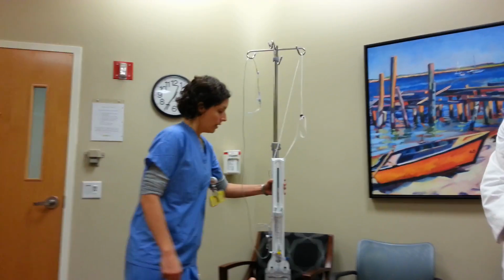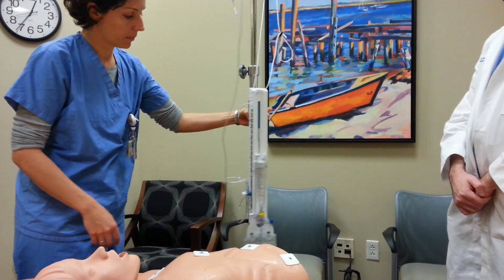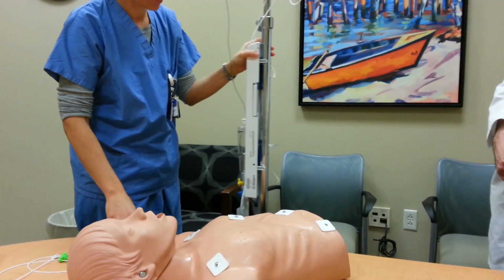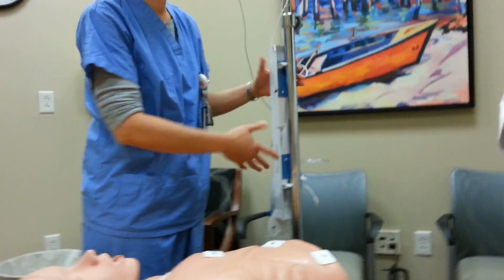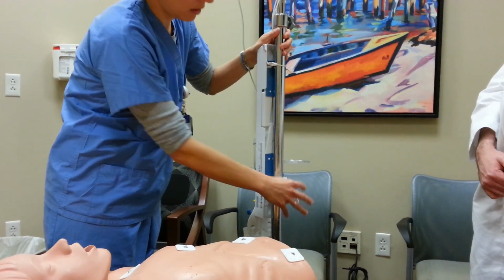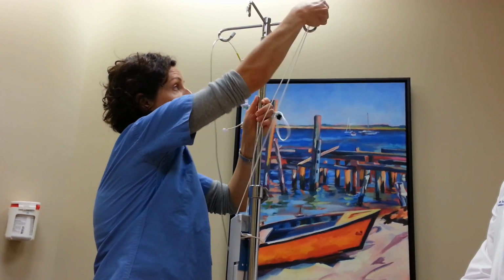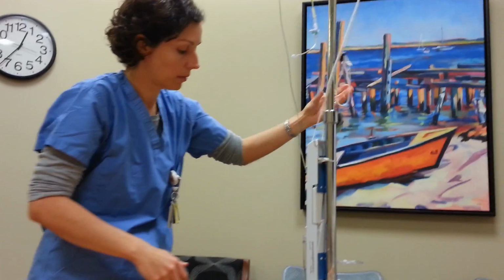Okay, so this is the burette as it comes out of the box. It attaches to the IV pole by squeezing a lever on the side here. Squeeze it, and it attaches to the pole. There's a couple extra safety mechanisms in place to make sure that the burette does not come unattached from the pole and as a result change its level in relation to the patient. One way is that you pull the rubber bands like so, and the second safety mechanism in place is this string which you can attach to the top of the IV pole and then cinch tightly in place. So again, if it falls off here, there's something else holding it in the same position.